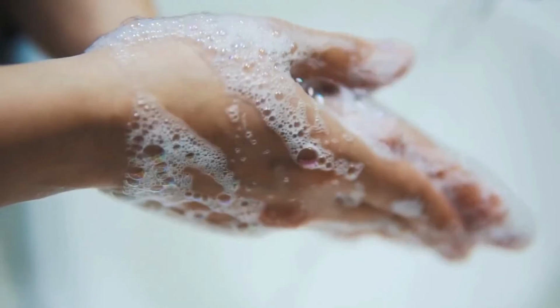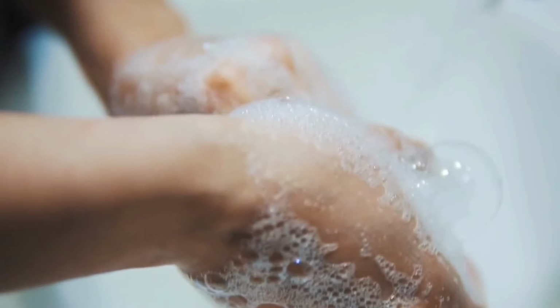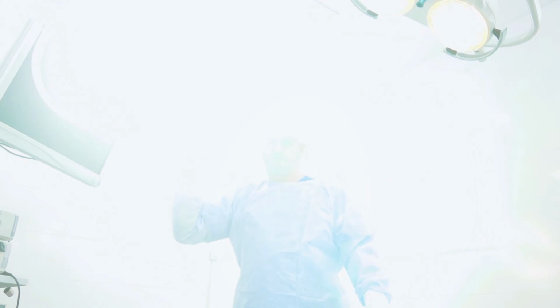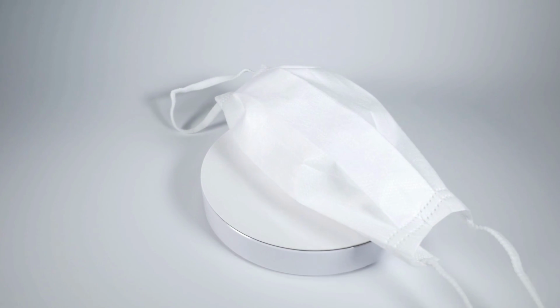Number 4, wash your hands every time you need to handle your catheter. Number 5, clean your skin where your catheter enters your body every day as instructed by your healthcare team. And lastly, wear a surgical mask when performing exchanges.